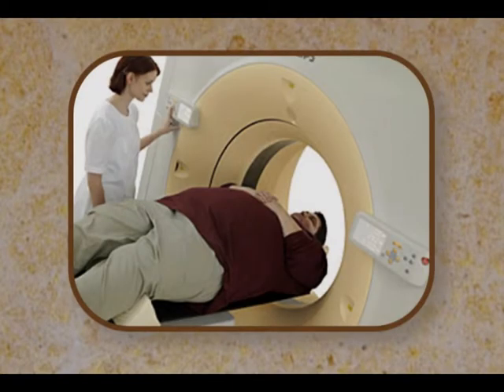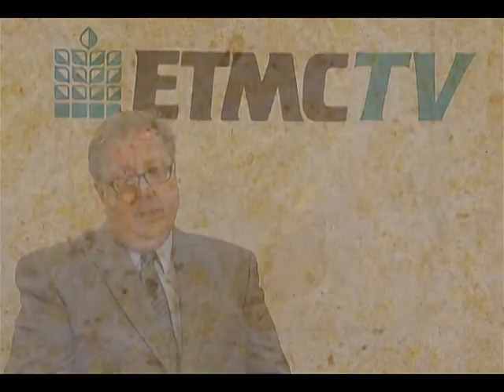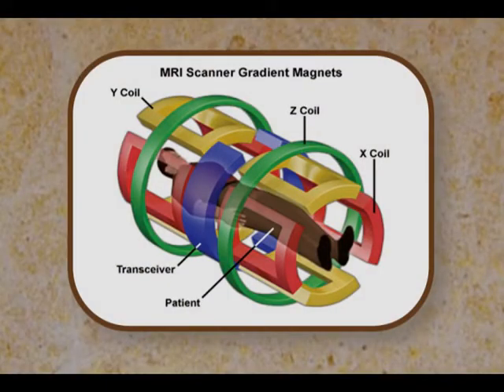We've installed a new MRI, and it's a large bore MRI. Large bore means a larger opening for the patients to be scanned in. That helps with patients who may be claustrophobic. Patients who couldn't normally tolerate an MRI may well tolerate it in this larger bore MRI. It also comes with new technology, new coils, and new software that gives us excellent images. It's a little bit faster than the other MRIs because of the coil technology.